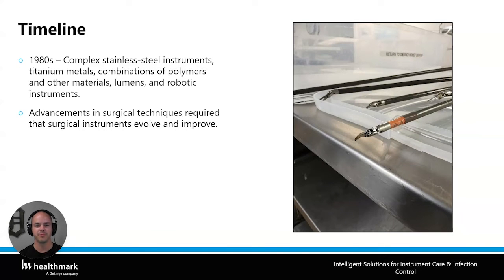And then we end up with robotic instruments. All of these things are enabled because of antisepsis and anesthesia. That allows us to focus on advancements in surgical technique, which requires all of these surgical tools to advance as well. So very interesting, I thought.